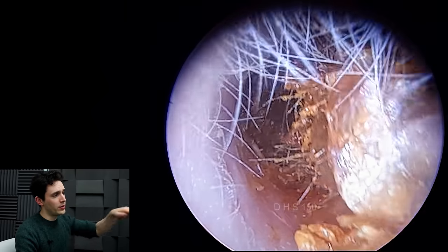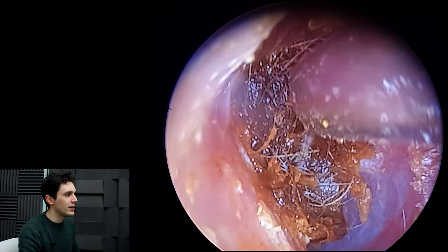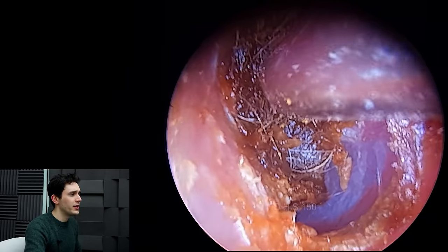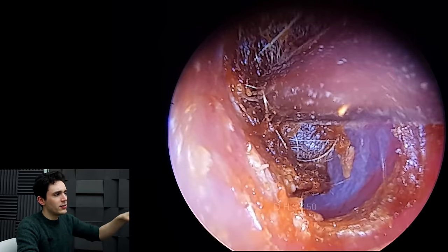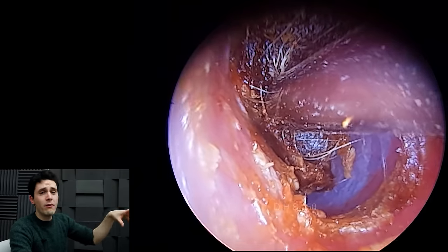So there we go — we can now just see a little bit of the eardrum. It's that kind of bluish-gray skin. All we want to do really is just to reveal the eardrum. I was slightly worried that it was perforated given the amount of pain he was in. But again, you can see the debris is really just a thick mesh of hair and wax.